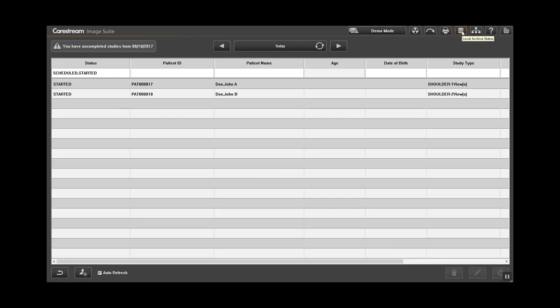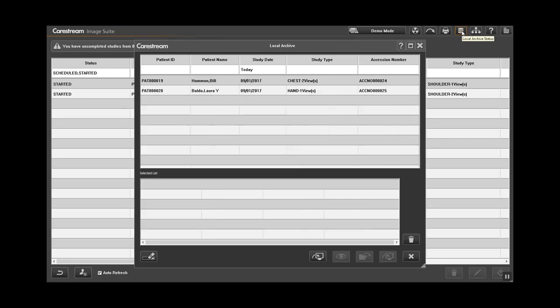Select the patient you want to archive to CD. That patient will be highlighted and added to the selected list below. Insert a blank CD into the CD reader.